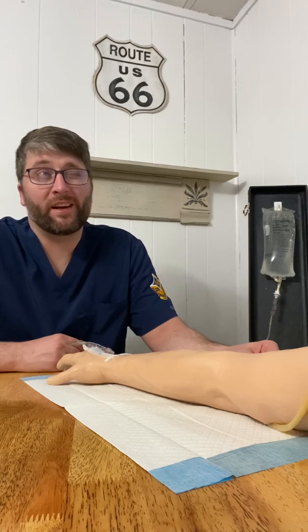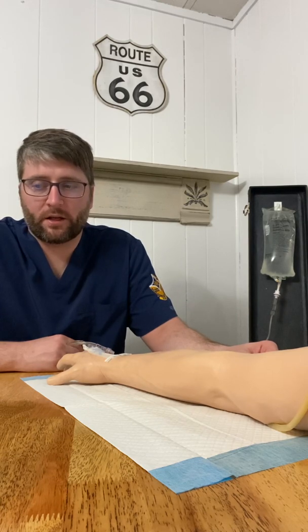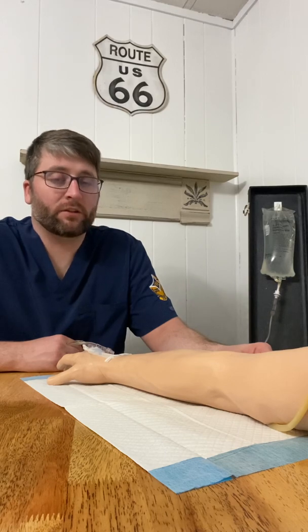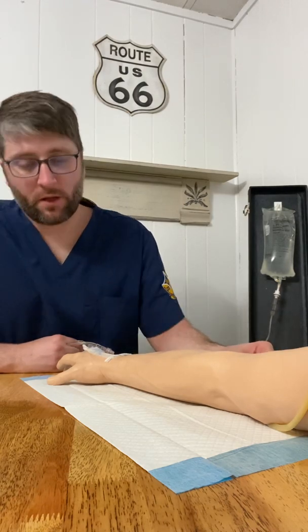We are going to abide by our 6 rights of medication administration: right patient, right drug, right route, right dose, right time, and then our right documentation. We're going to perform hand hygiene and keep all safety precautions in place and abide by facility policy and procedures. We're going to make sure that our medication dosage is correct for our patient's age, weight, and condition.